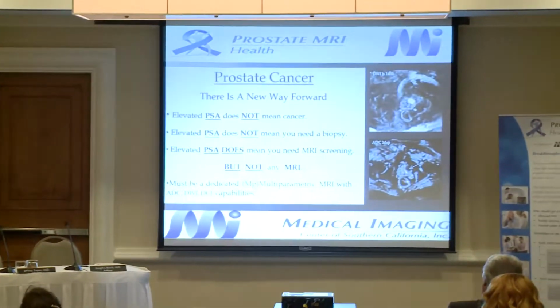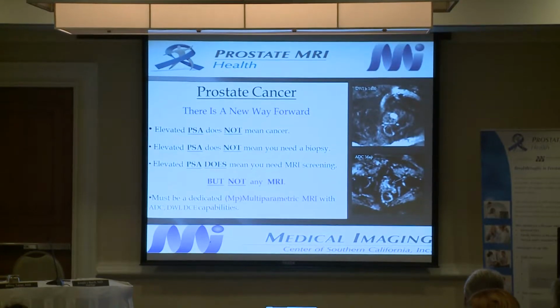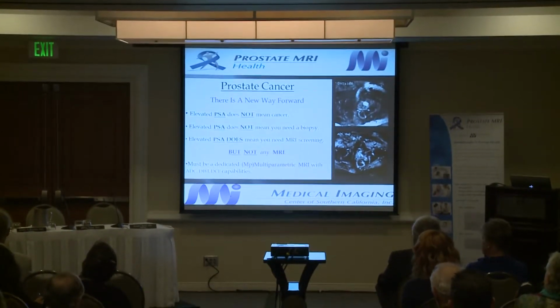So these types of MRIs are multi-parametric MRIs that are generally high field, which means 3T, and you really need to have the sophisticated capabilities to do diffusion-weighted imaging, as well as ADC maps and dynamic contrast enhancement, and have the sophisticated software which Yeli will talk to us about tonight. Over here we can see a classic example of a prostate cancer that, with the ability to do DWI imaging with a B-value of 1400, calculated B-value that most scanners can't do, and the concurrent ADC maps showing the restricted diffusion, you can sort out whether a lesion is a cancer or not.